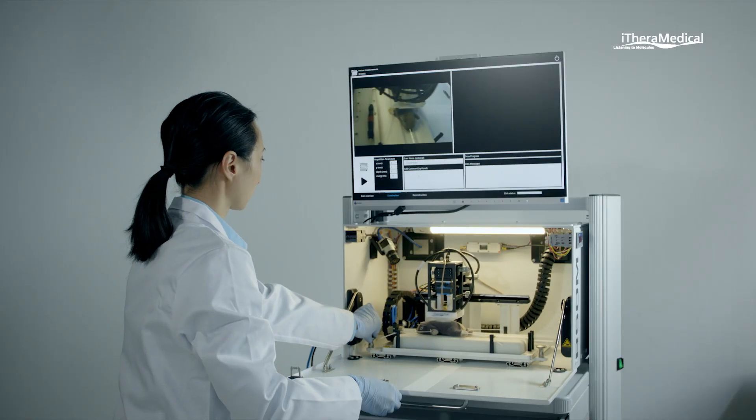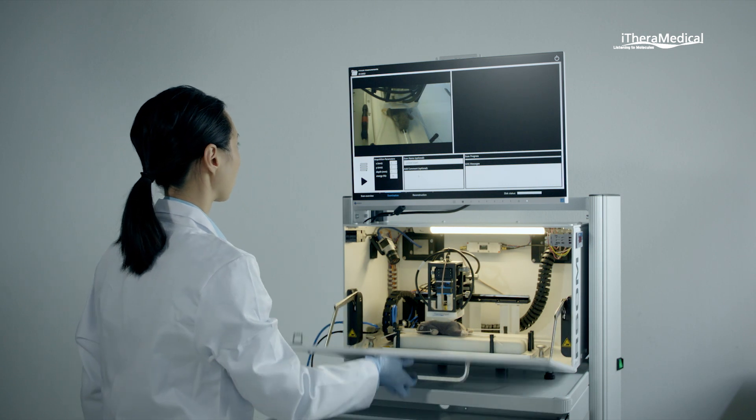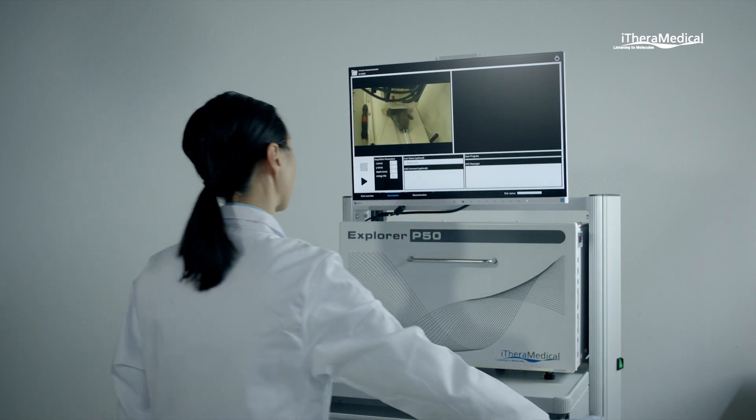The animal bed slides into the imaging chamber, which must be closed during imaging to avoid exposure of laser light to the user.